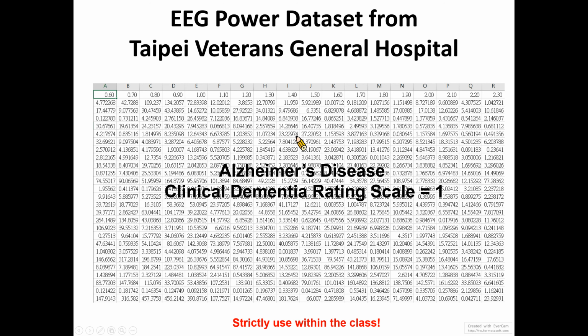So if you cluster the patients based on the EEG markers, you should expect there may be some difference in the MPI profile between different clusters. But if you just classify patients based on the questionnaires, then you should also want to validate these clusters by the EEG markers. So that also depends on your application and your hypothesis.